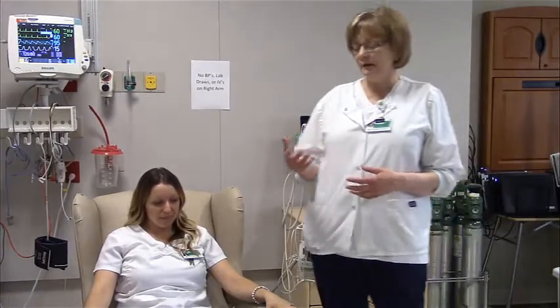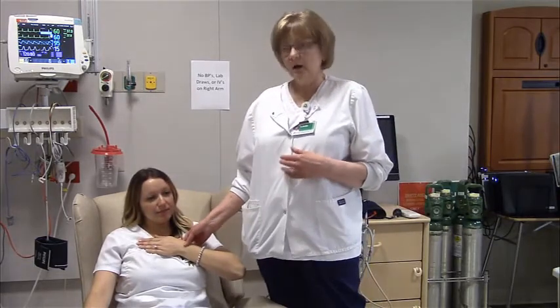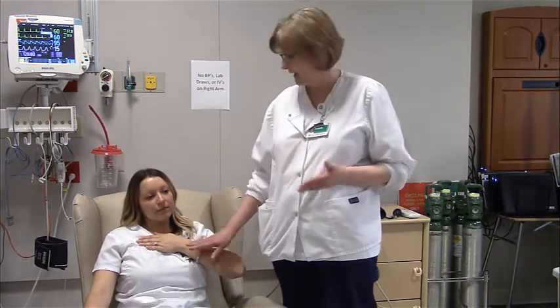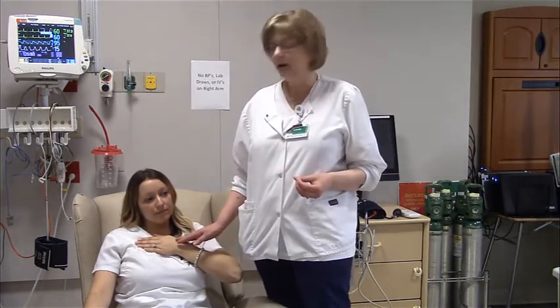Okay, and another thing that I want to go over is what we can do to check respirations: just have their arm lay across their chest, and you can tell them that I'm checking your heart rate. Well, really, I'm not. I'm holding onto their arm and I'm counting the rise and fall of their chest so that I can truly get an accurate respiratory rate on them.